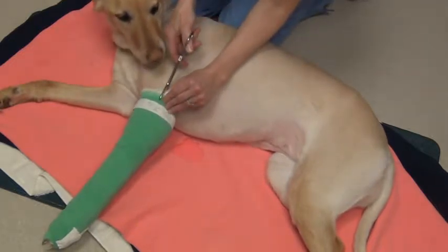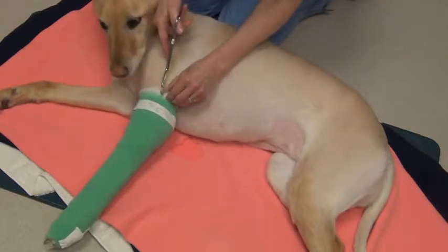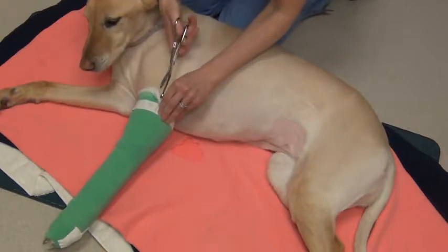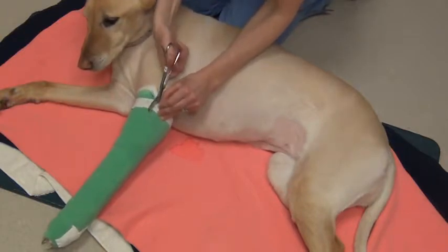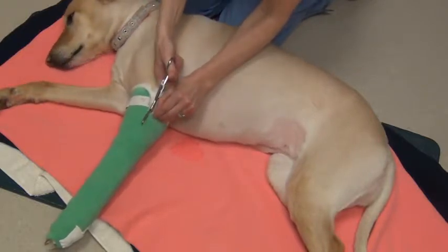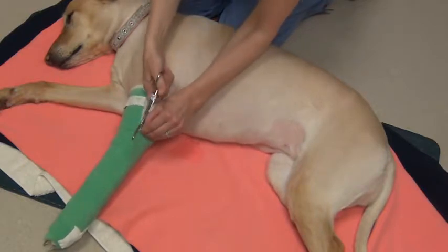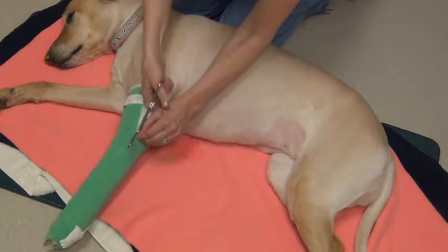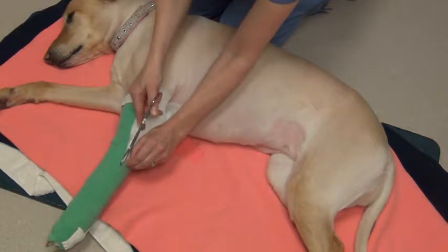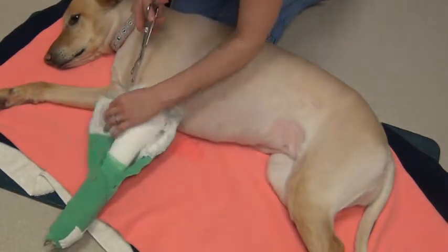I'm going to go ahead and slip the bandage scissors under the bandage. I'm going to be feeling for the layers and feeling for her leg. You can be even safer and take it off layer by layer, which might be the case with her because I made it so thick. Might be better to do it that way, to just use scissors and go little by little, safely, when you have something so thick that you're cutting through. Back up here.